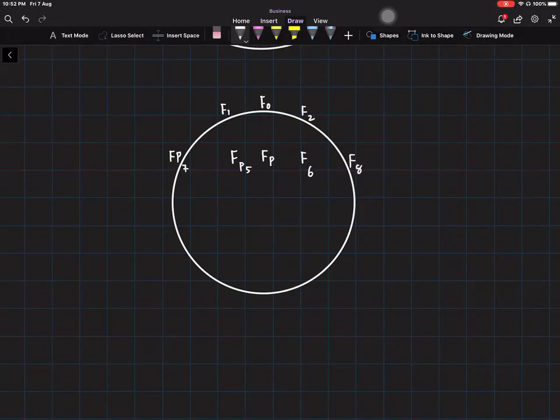The distance between them, I'll tell you afterwards. You have your C here, and you have your C3 and C5, and your C4, C6.